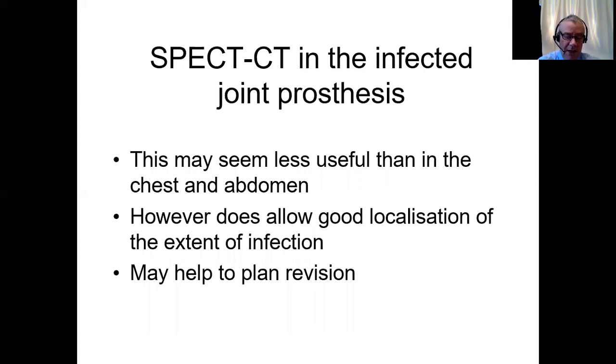Can SPECT-CT be used in infected joint prosthesis? Well, the answer obviously is yes.